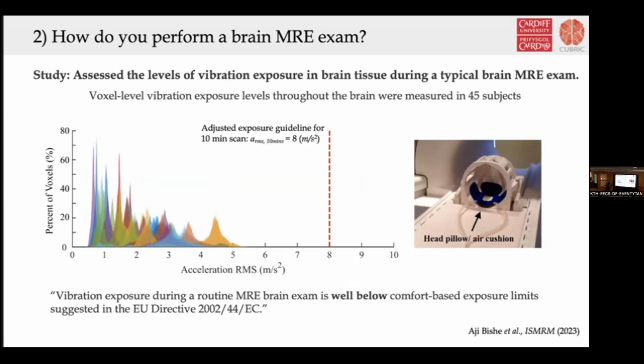That's because I think there are around 50 pillows being used worldwide, which has been a massive jump in the last couple of years. In this histogram, you can see the root mean square acceleration for each subject, and it's well below 8 meters per second squared, the maximum value suggested by the EU 2002 directive.